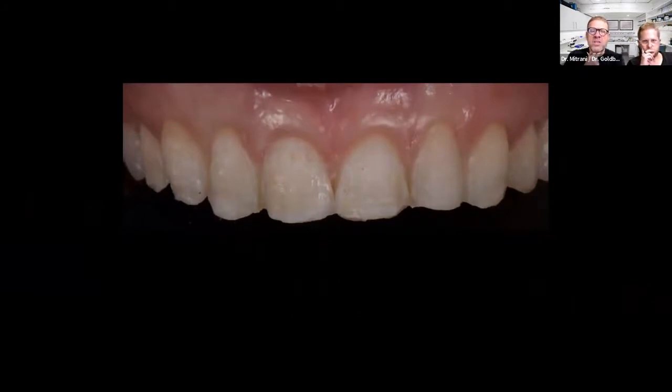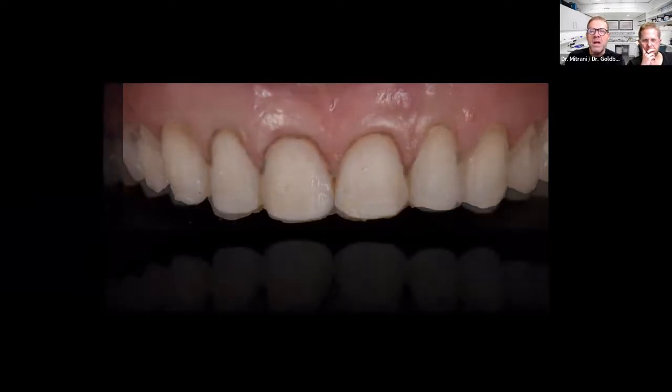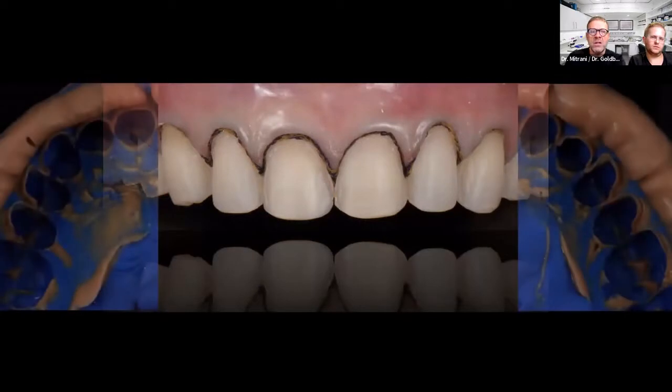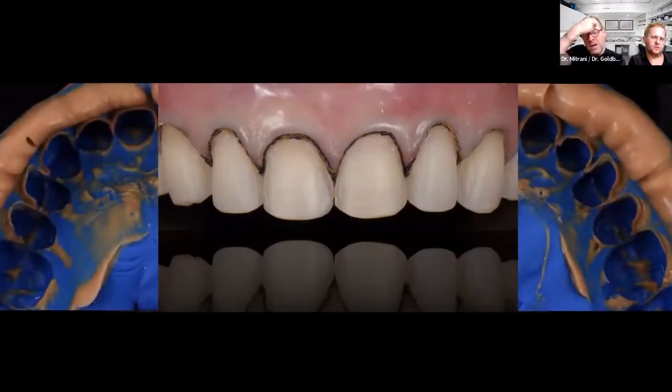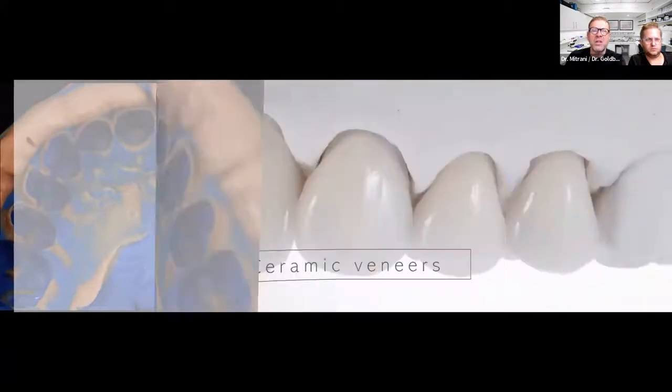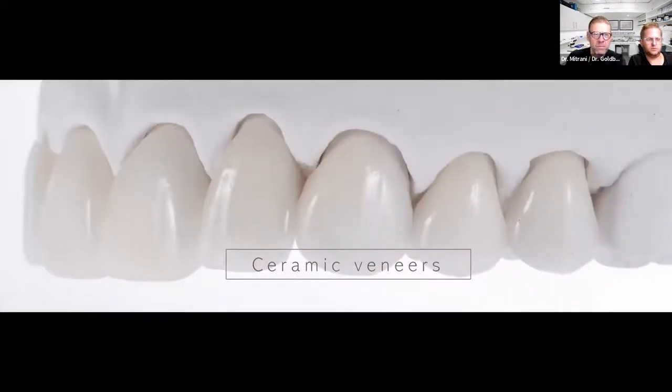And so notice from this transition how it's just a matter of cleaning up that resin cement, creating a new margin for our new ceramic veneers, utilizing our retraction cord to make sure that we have a clean impression and that all these margins are adequately transferred to the laboratory. And some of you may be utilizing intraoral scanners and IOS protocols to transfer this information to the lab. This year we started utilizing our digital scanners pretty diligently, as often as we can, as well.